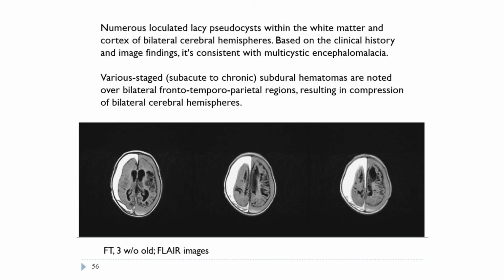Clinically, he had no eye contact with floppiness and was fed by NG tube. At the first day we took care of him, there were no endotracheal tube, no NG tubes. We didn't foresee that the outcome was so grave. EEG turns out to be the most early and precise indicator for prognosis.